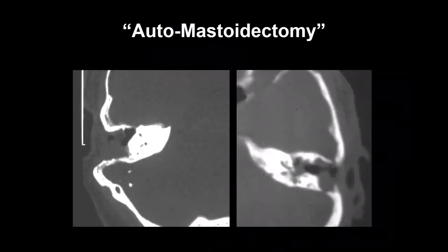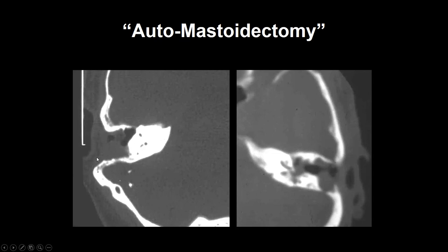One phenomenon that cholesteatoma can produce is called an automastoidectomy. That is, it can erode the bone sufficiently in the mastoid air cells as well as the middle ear cavity so that it looks as if the patient has had a post-surgical canal wall down mastoidectomy — even though this patient has had no surgery. The soft tissue cholesteatoma has eroded all of the ossicles as well as the mastoid air cell septations. Here is another example of cholesteatoma eroding portions of the mastoid with no middle ear ossicles — the so-called automastoidectomy.